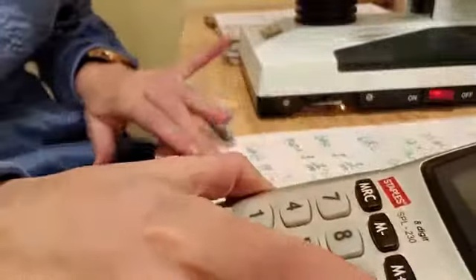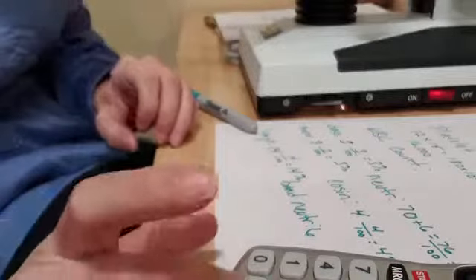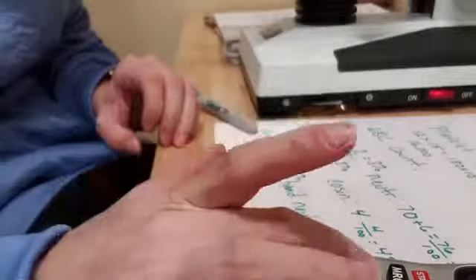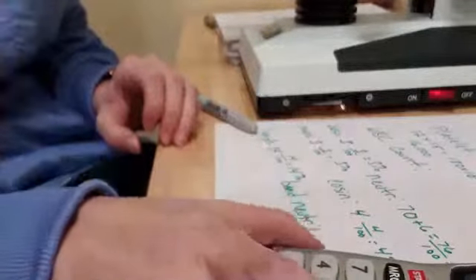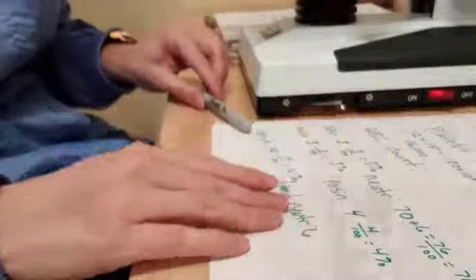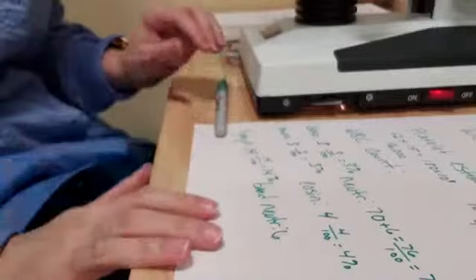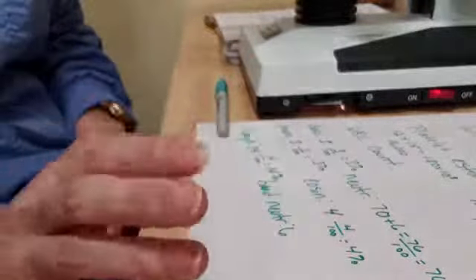And I like to double check it even though I know we had the counter to make sure that it all adds up to 100%. So we'll do that now. So 3 plus 3 plus 14 plus 76 plus 4 equals 100. So we have our white blood cell count for each type of our white blood cells.